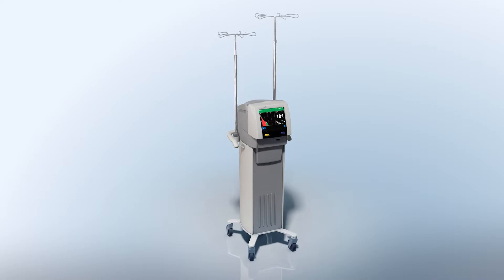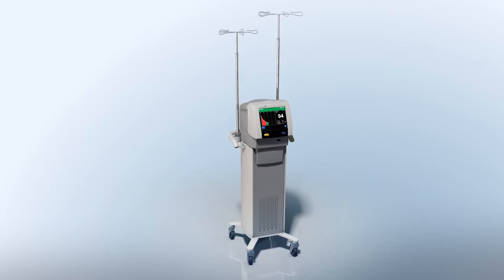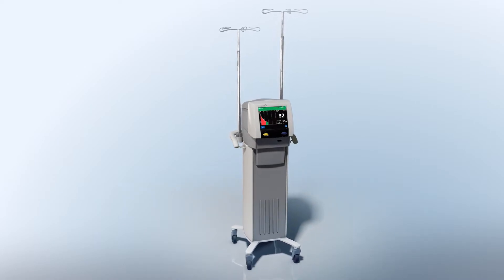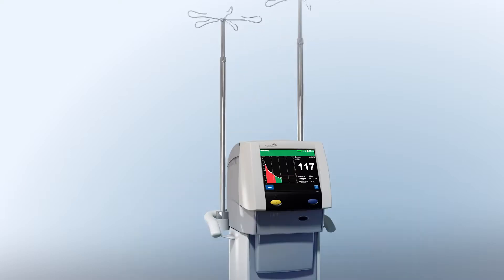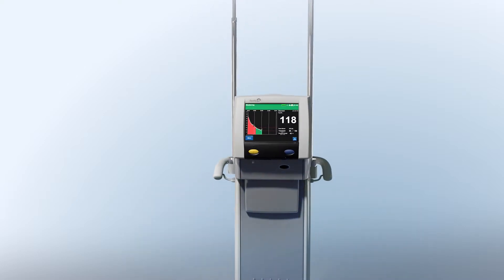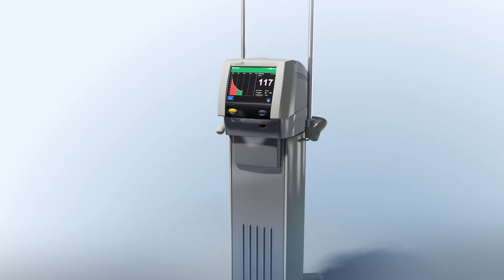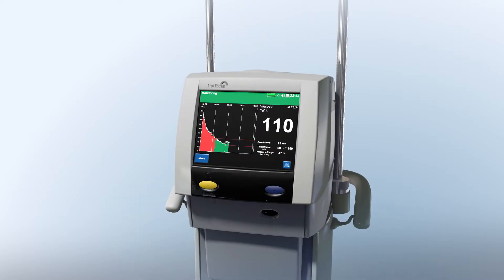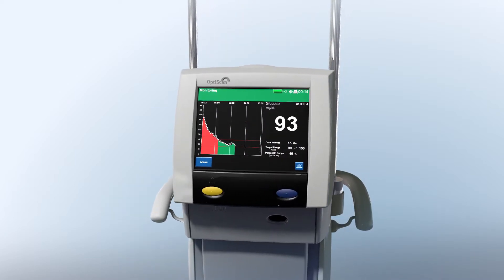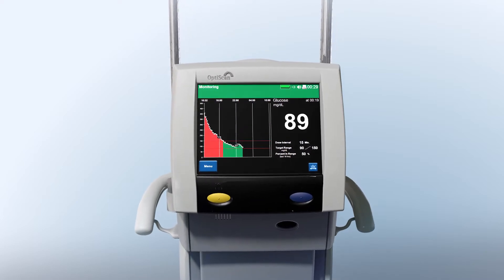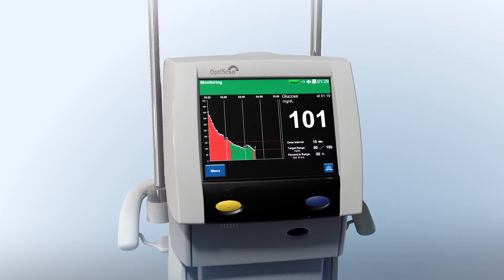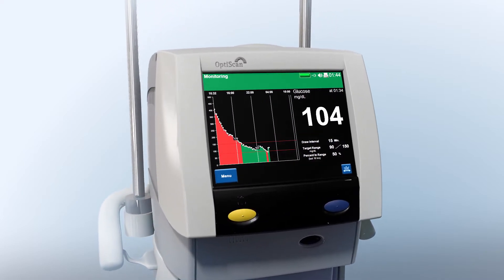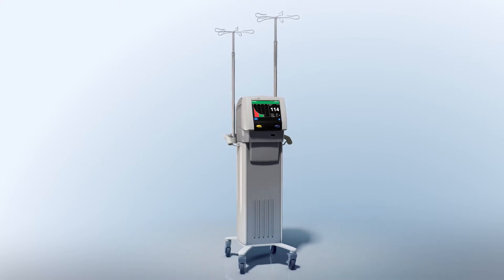OptiScan Biomedical has developed an automated bedside blood monitoring platform for use in intensive care units. The OptiScanner 5000 represents the first step in the development of this platform. The system automatically measures and trends plasma-based glucose levels to enable early detection of hypoglycemia, hyperglycemia, or glycemic variability.